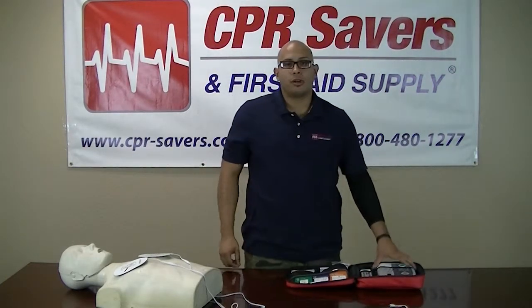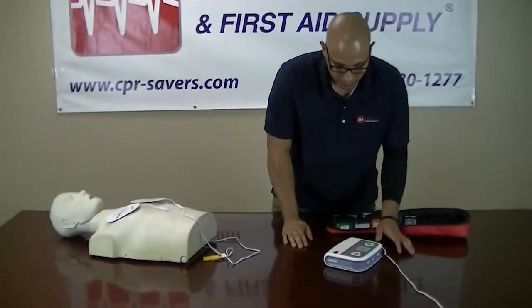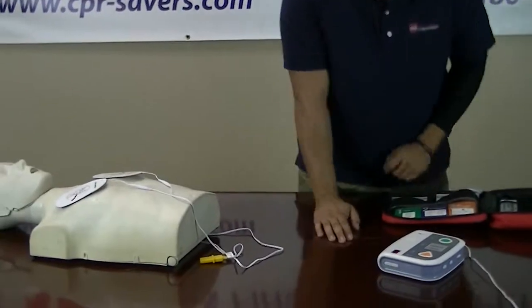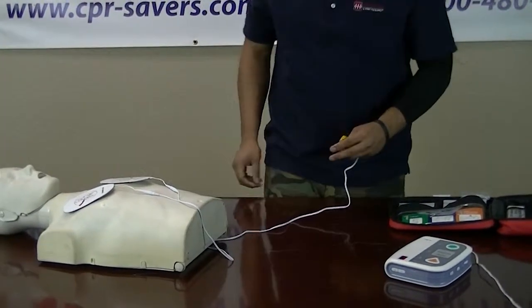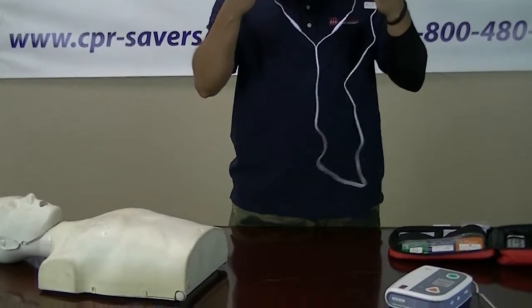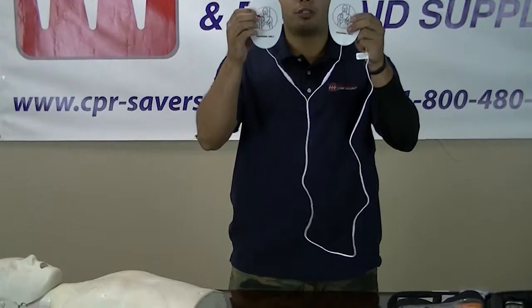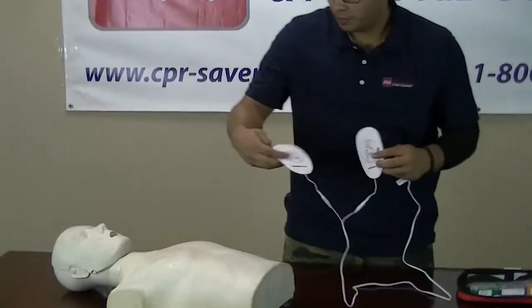And now I will be showing a demonstration on how to use the trainer. Make sure you are looking at the pictures on the pads because it will instruct you where the pads will be placed. Apply pad plug-in connector.